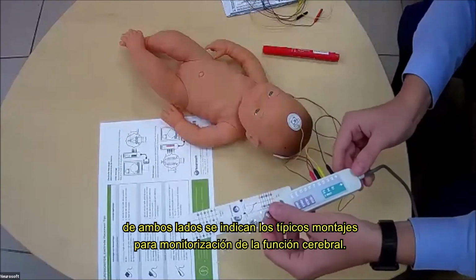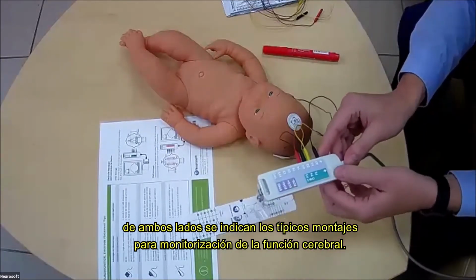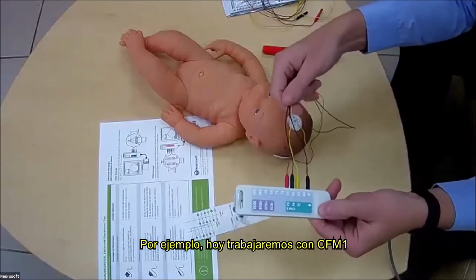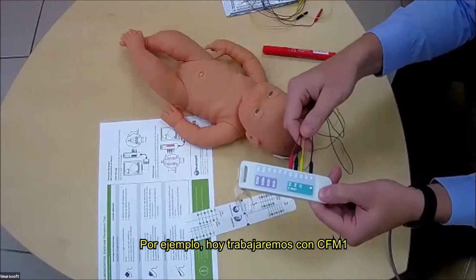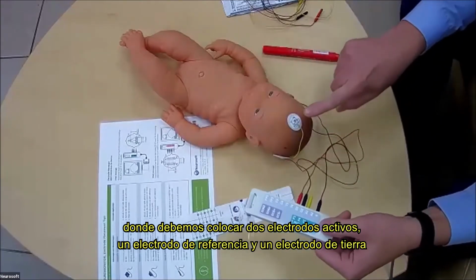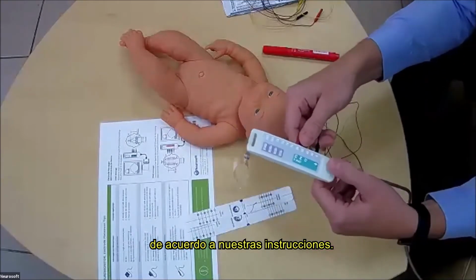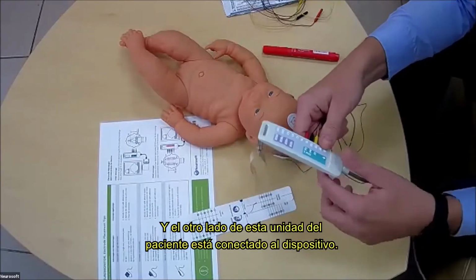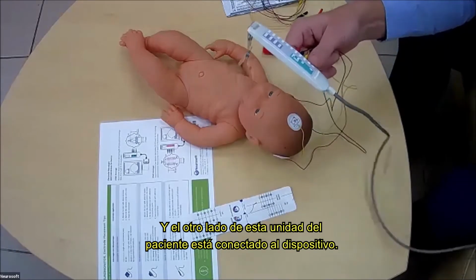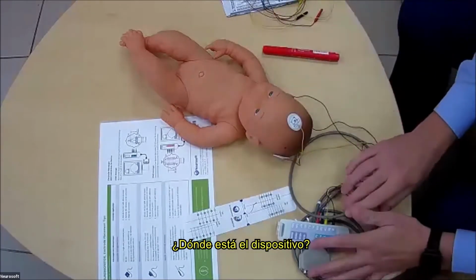Then we have the special patient unit with marking from both sides. It is marked with the typical montages for cerebral function monitoring. For example, today we will work with CFM1, where we need to put 2 active electrodes, 1 reference electrode, and 1 ground electrode, according to our instruction. And another side of this patient unit is connected to the device. Where is the device?